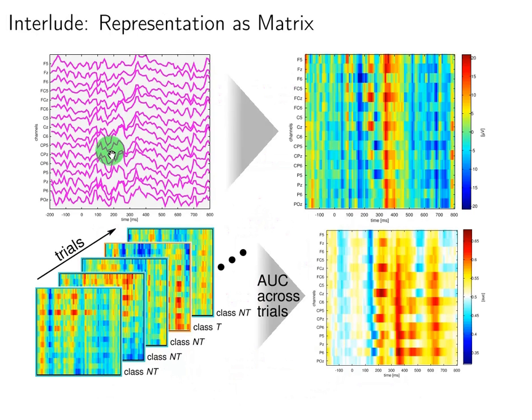Another way to visualize and interpret the EEG data segmented from the Oddball experiment, where we are analyzing ERP target and non-target, is as follows. These are what we can call heat maps, representing the amplitude values of the EEG data.